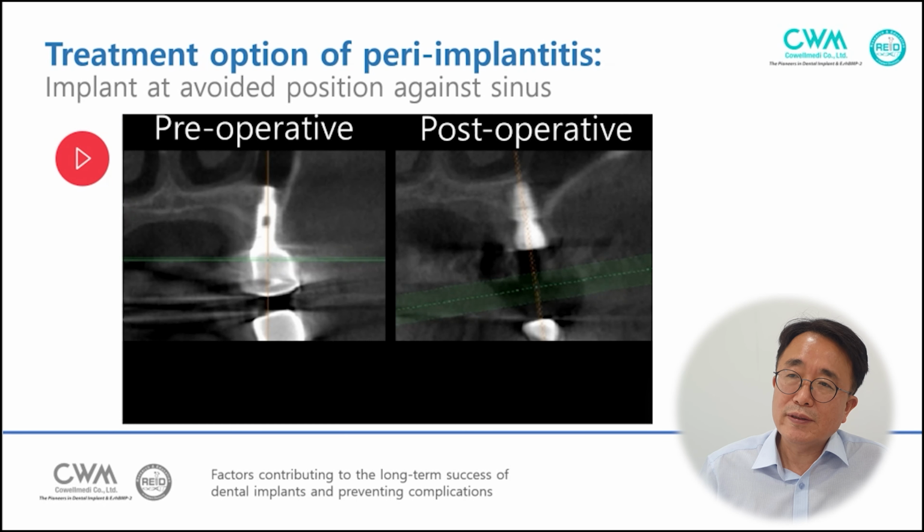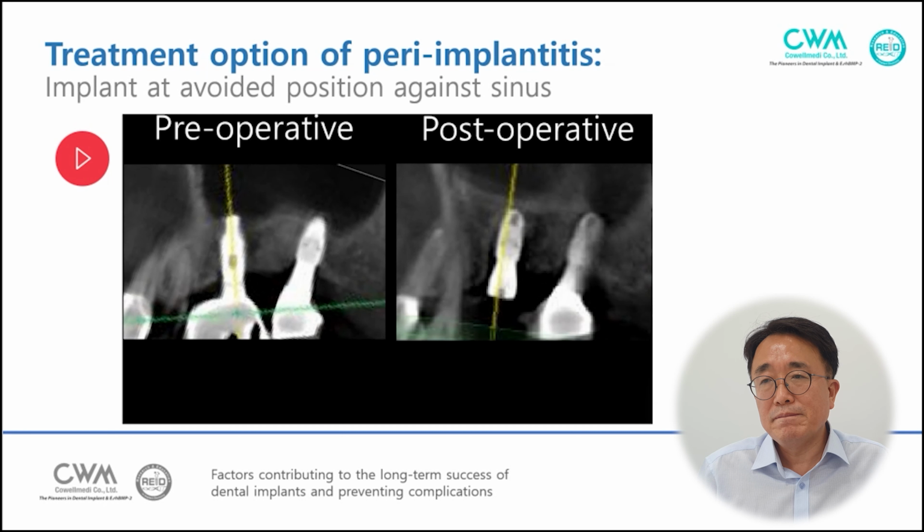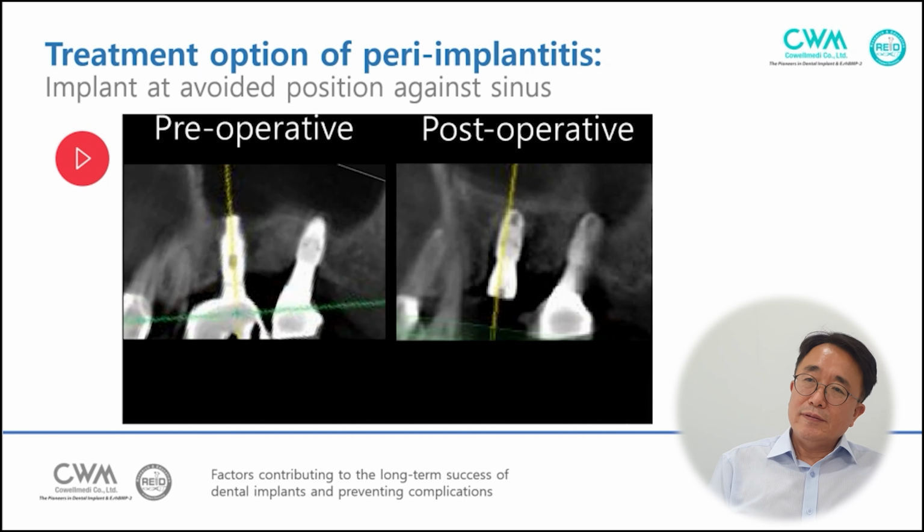Pre-operative or post-operative. So this fractured implant doesn't have inflammation, only chronic granulation tissue. So we can insert the implant immediately after removal of the remaining fragment.